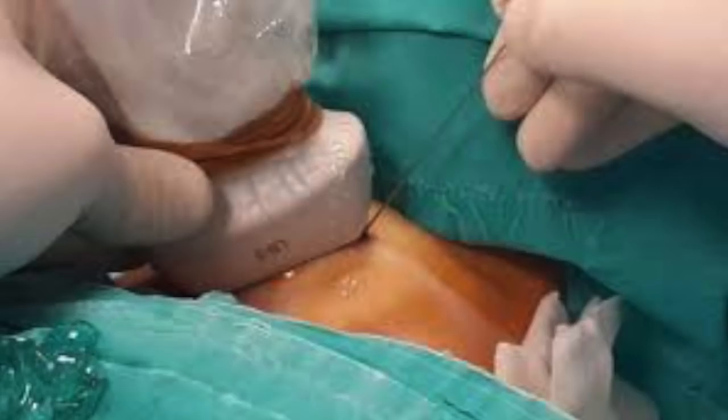A common problem is that the needle is seen when it enters the skin but is lost as it advances toward the lesion. Some doctors blindly agitate and complete the FNA — this is absolutely not recommended. Instead, mildly withdraw the needle, keep scanning continuously, and move either the probe or the needle — but not both. Once the needle is visualized, maintain the same probe position and angle and carry on with the FNA.